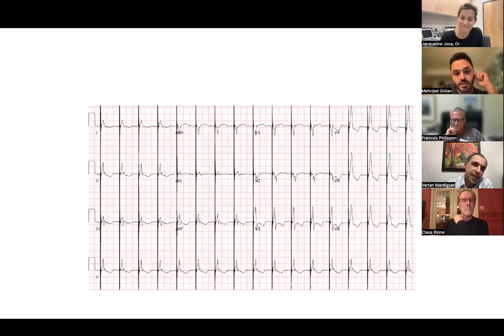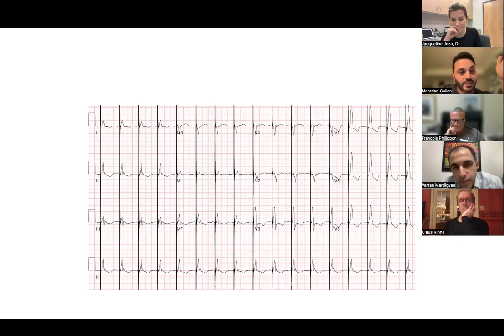I tried with unipolar, obviously, as well as bipolar. I couldn't get anything better than that. So I left it again. LVAT time, depending on where you pick the beginning and end of the pacing spike, is not terrible. It's around 80 milliseconds or so.